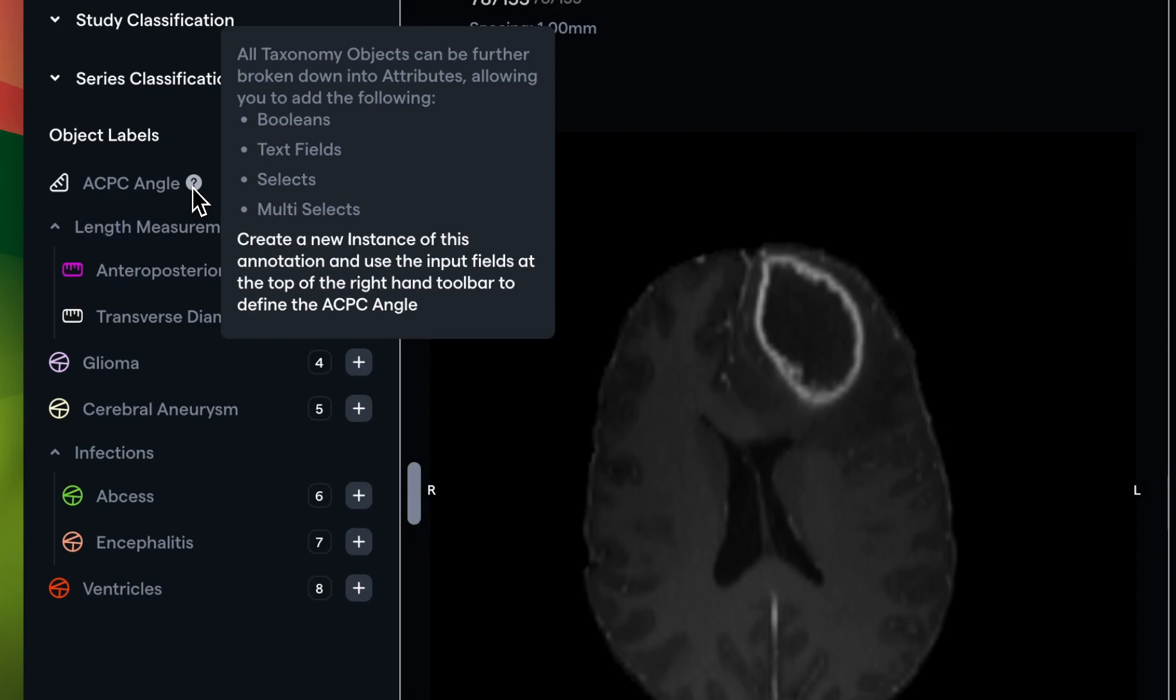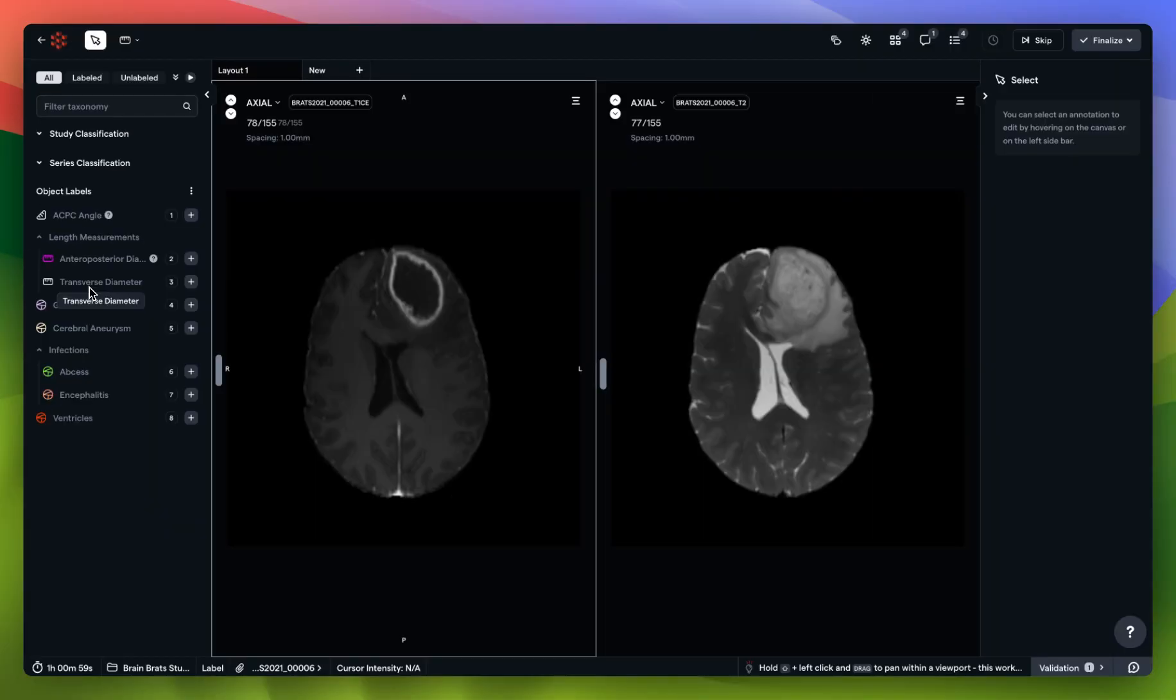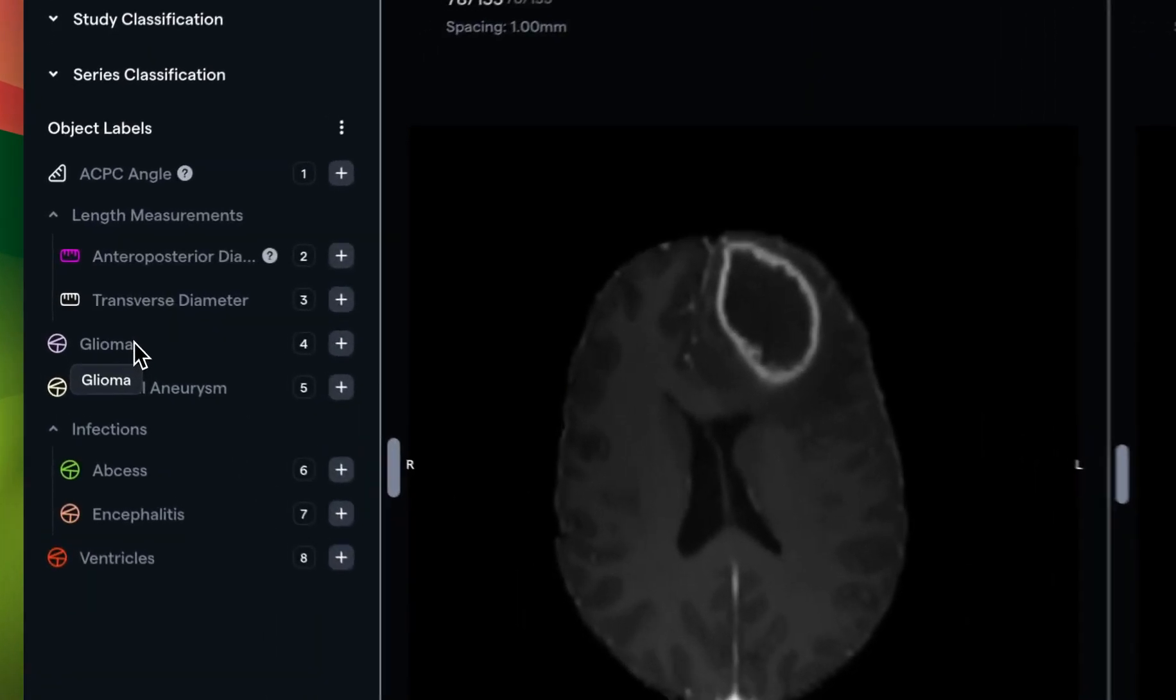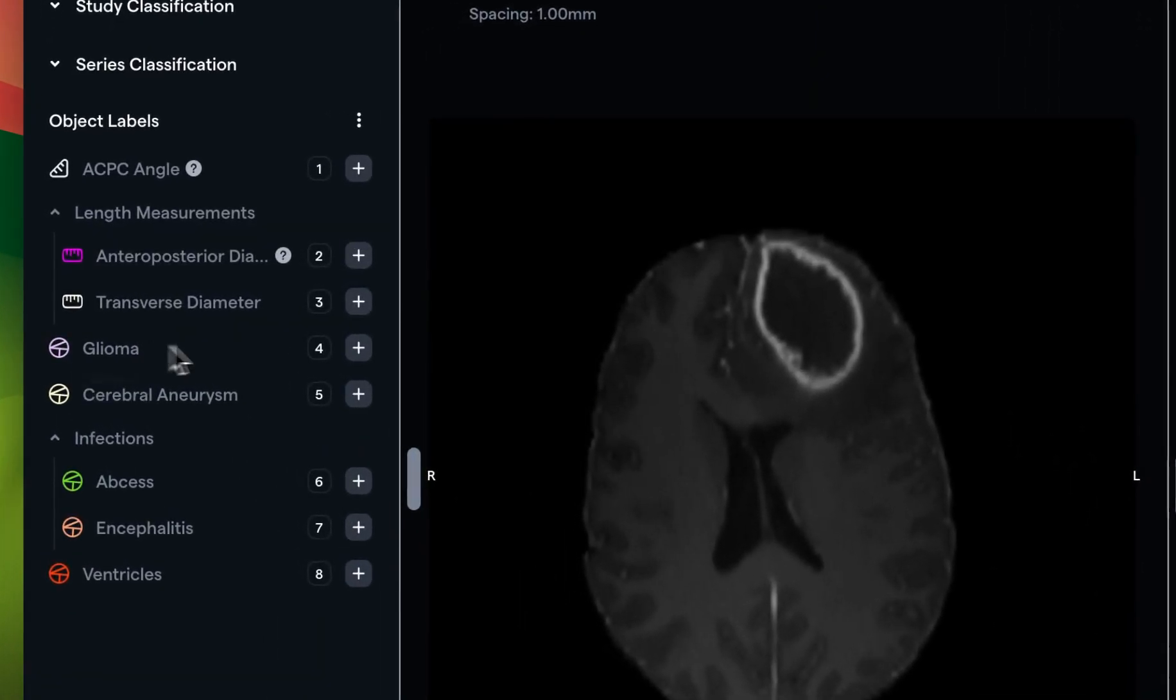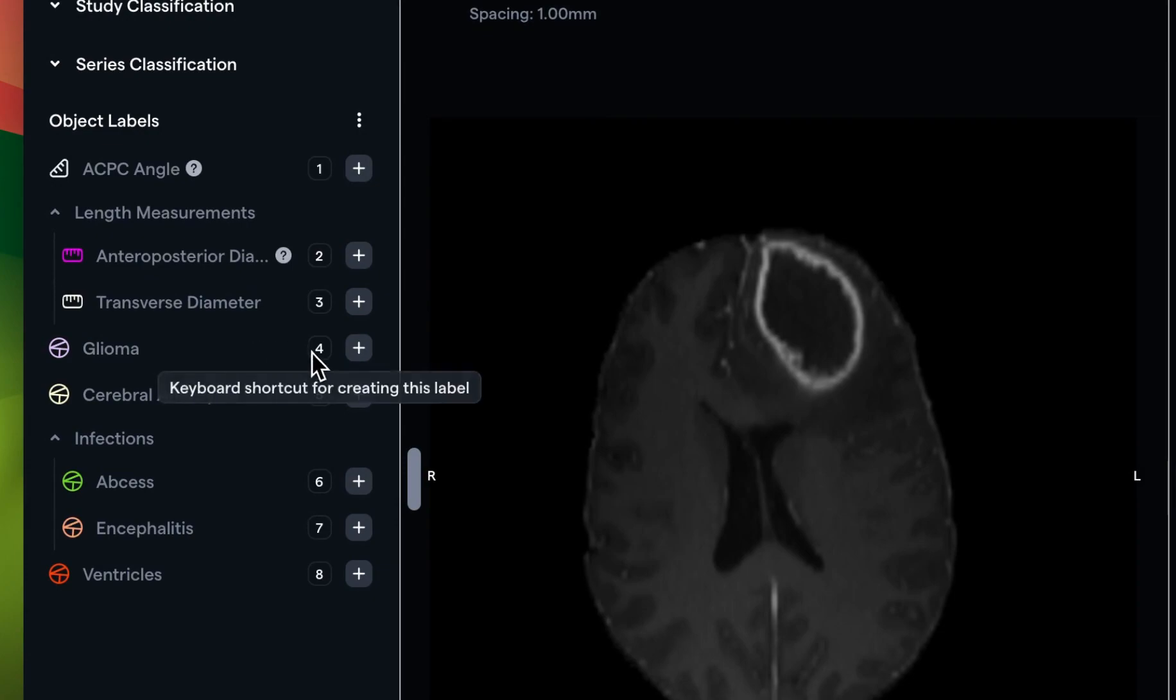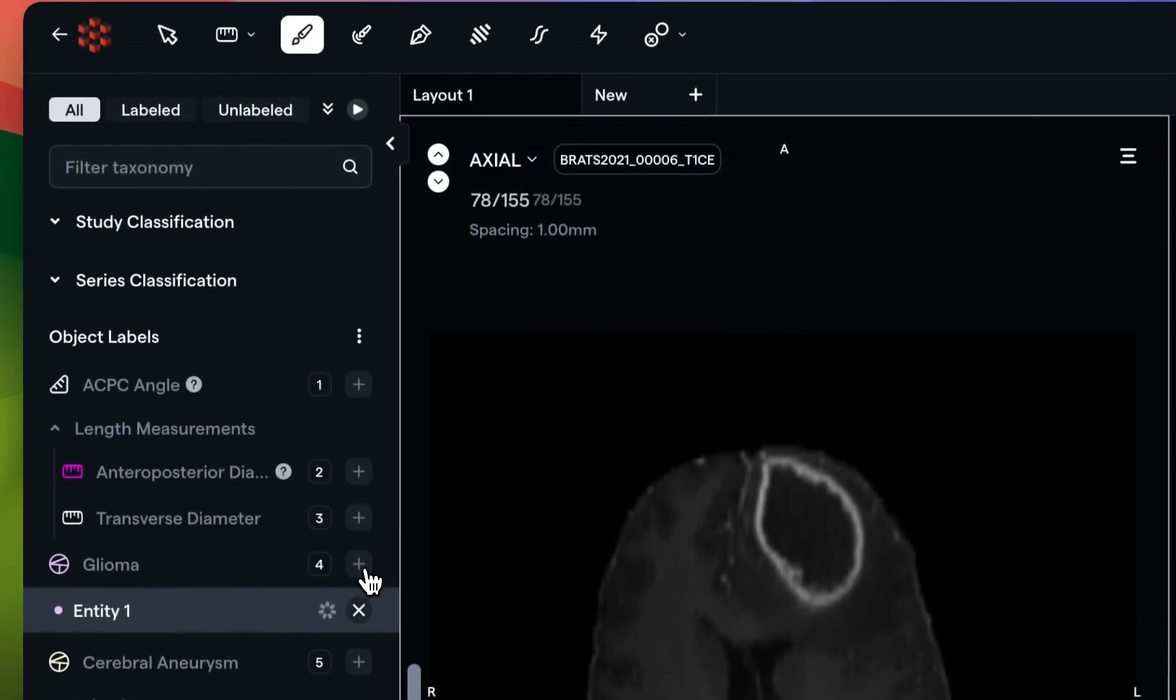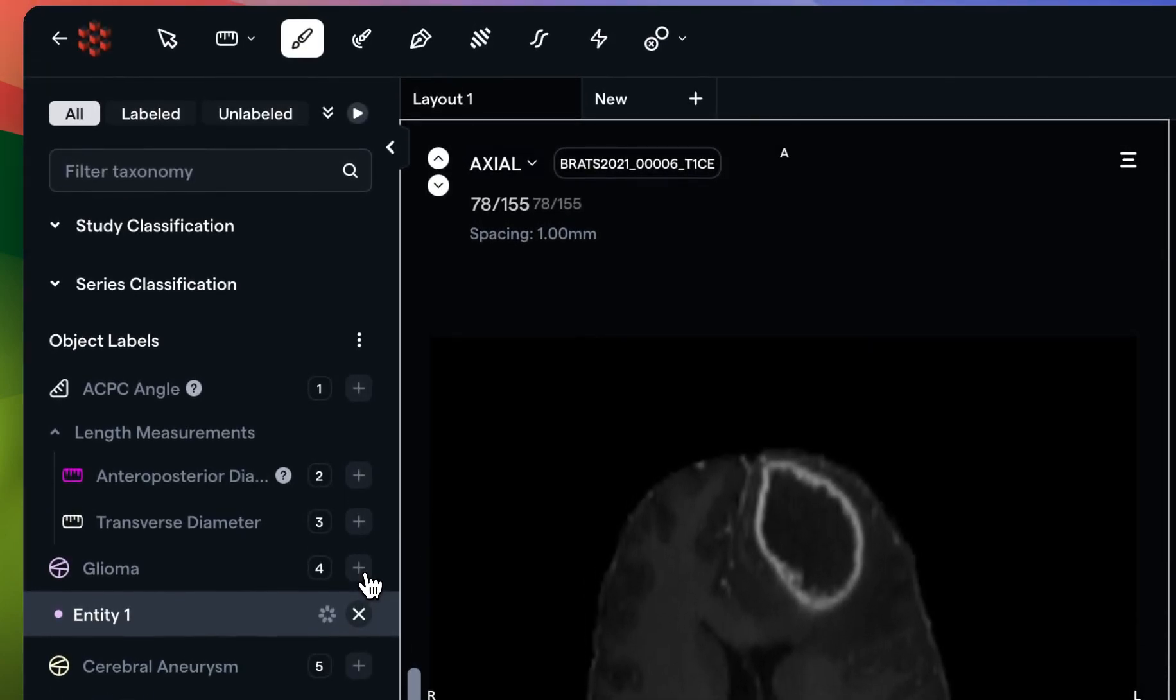In order to create an object label on redbrick.ai, all you have to do is choose the one that you'd like to create and either use the numeric hotkey that we list in the left-hand toolbar here or click on the plus sign. After clicking on the plus sign, you'll see that because the glioma is a segmentation, our segmentation toolkit has appeared at the top of the screen.